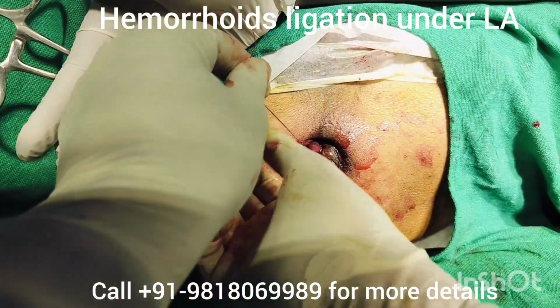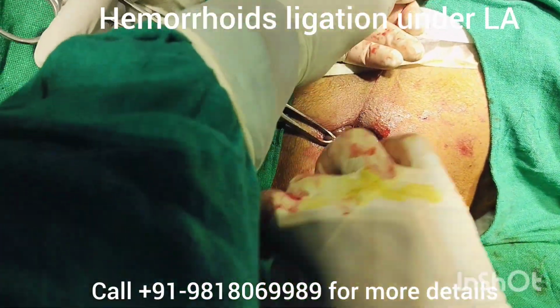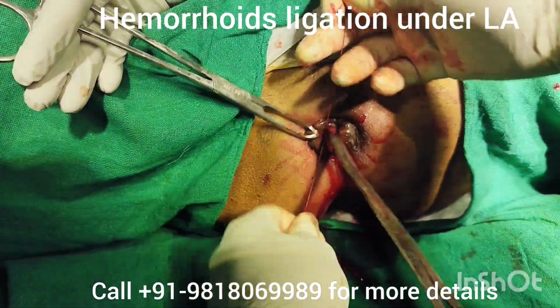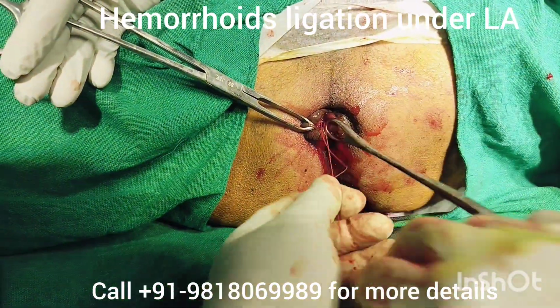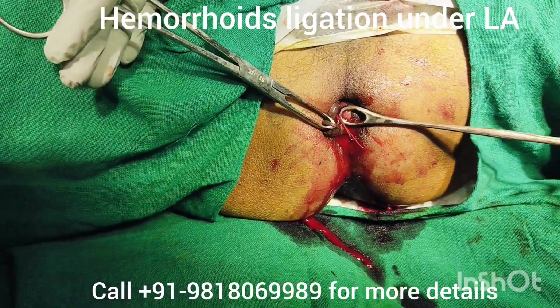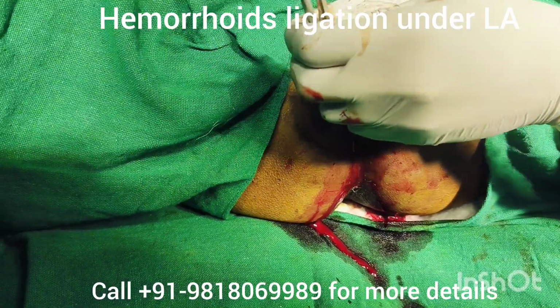In this way, through a single thread, we have ligated two pile masses. One is at 7 o'clock position and another is at 11 o'clock position. And finally it's done. Now we shall proceed for the pile mass at 3 o'clock position.